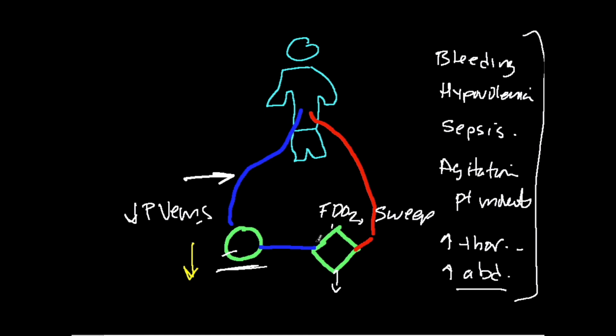In the meantime, if there's a plausible story that it's bleeding or hypovolemia, you're going to start giving volume, take a look at the hematocrit, and make sure that there's not a bleeding event. And if so, you're going to try to achieve source control. The sources can be a little bit elusive. Anything you've touched in an ECMO patient can bleed, even days after you've touched it.